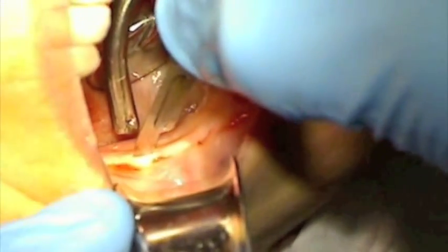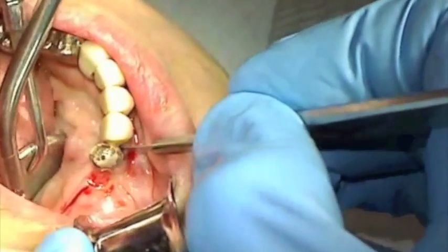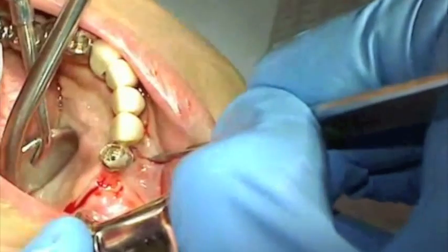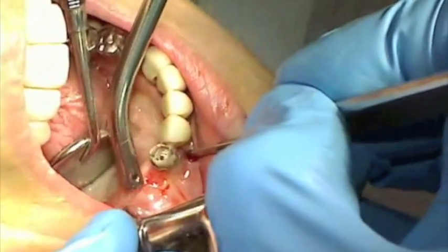The initial incision should be made with firm, definite pressure and a continuous line on the crest of the ridge bisecting the attached mucosa. A releasing incision is made one tooth anterior to the mental foramen to avoid damaging the nerve. All incisions are made through the periosteum scoring the bone.